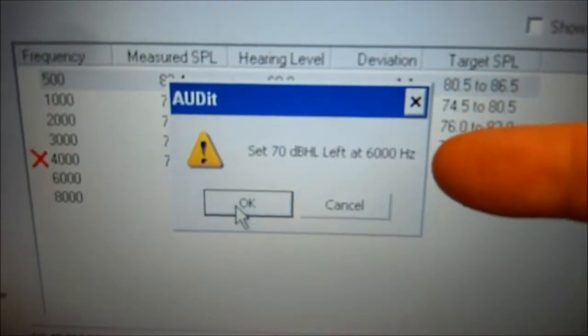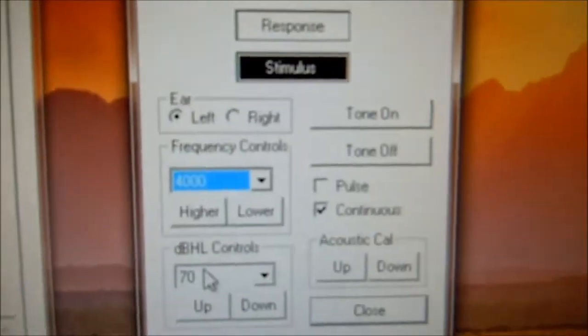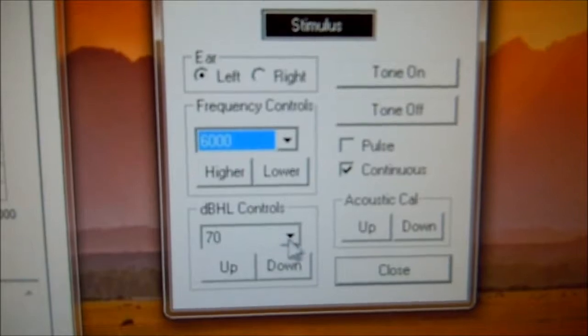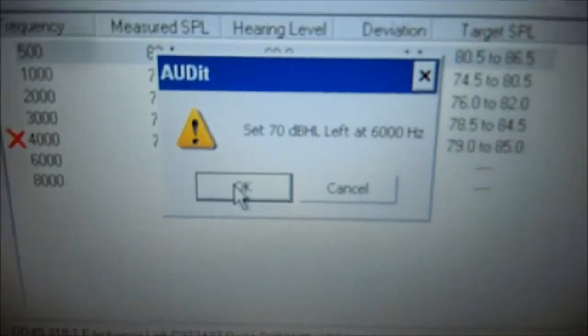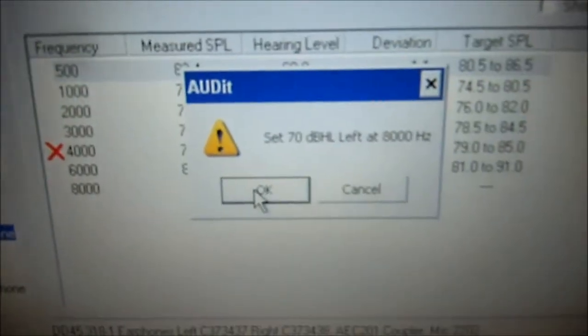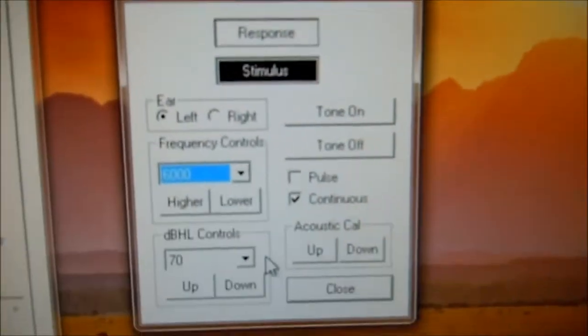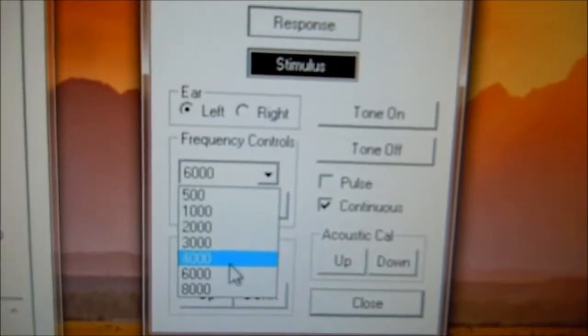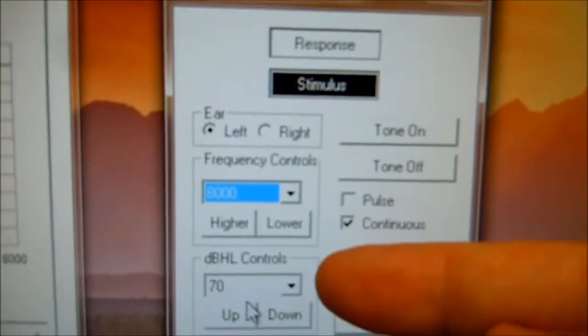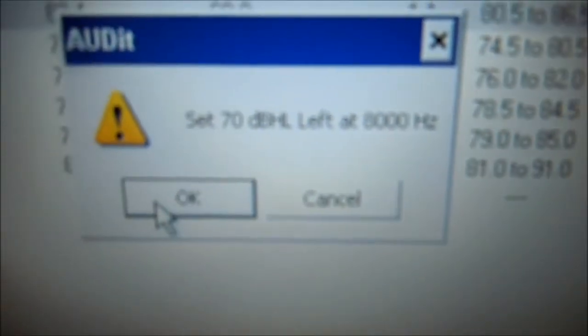So right now let's select 70 dB at 6,000. Back at the audiometer, select 6,000. We're at 70 dB, the tone's on. Come back to the audit software, select OK. Now 70 dB at 8,000. Come back to the audiometer software. We're going to select 8,000 Hz at 70 dB, tone's on. Come back to the audit software, press OK.